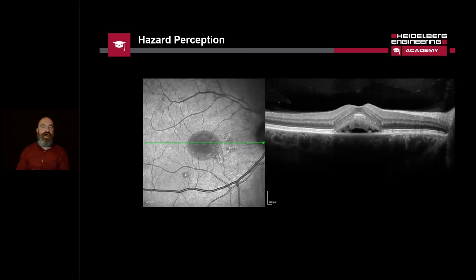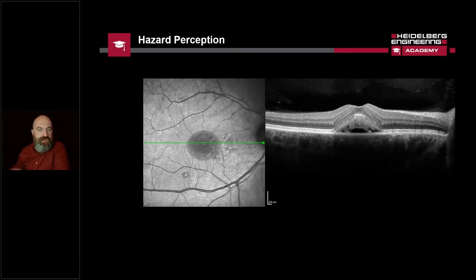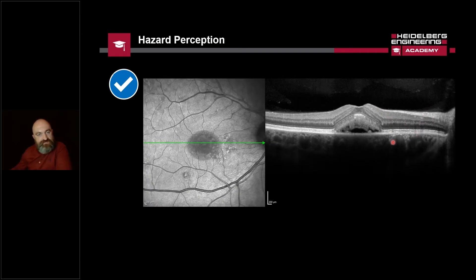So here we have some pathology — there are some obvious changes on this retina that differentiate it from a normal scan. Let's go through our iWay Code process. The first thing we want to check is: do we have good signal quality? Looking at this B-scan, I can see all the contrast between all the different layers from top to bottom. I can even see different structures in the vitreous and down into the choroid on this B-scan, establishing that we've got very good signal quality.